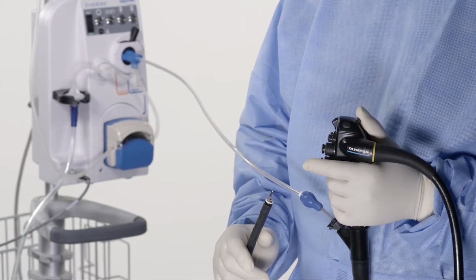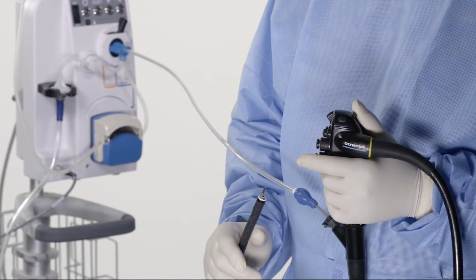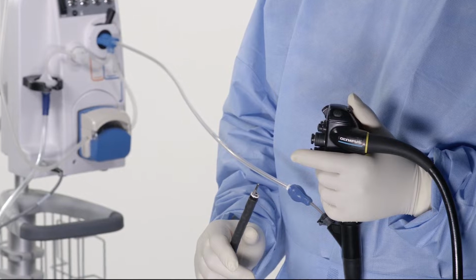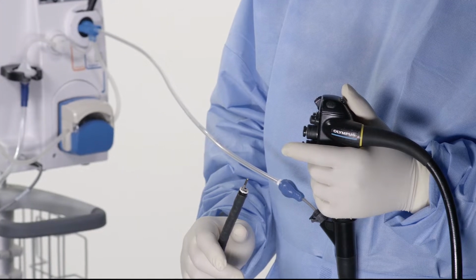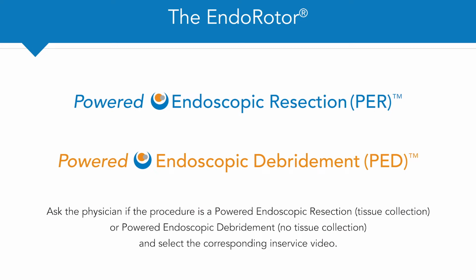Ensure the correct catheter length is selected for the appropriate scope. The catheter requires a 3.2 mm endoscope working channel. If you have additional questions on the catheter selection, please consult the EndoRotor Instructions for Use Endoscope Compatibility chart. Ask the physician if the procedure is a powered endoscopic resection, tissue collection, or powered endoscopic debridement, no tissue collection, and select the corresponding in-service video.